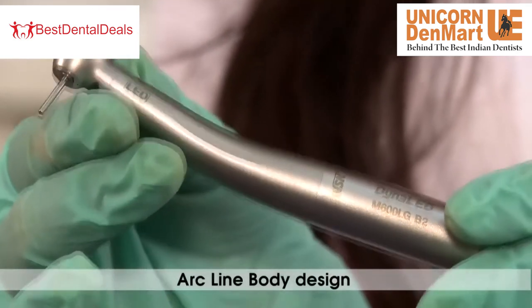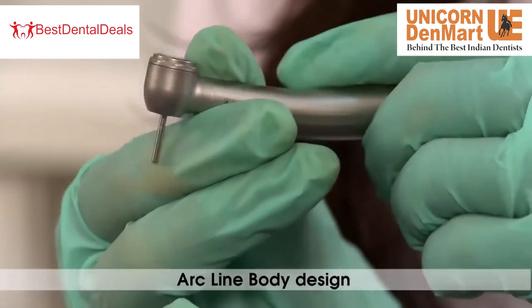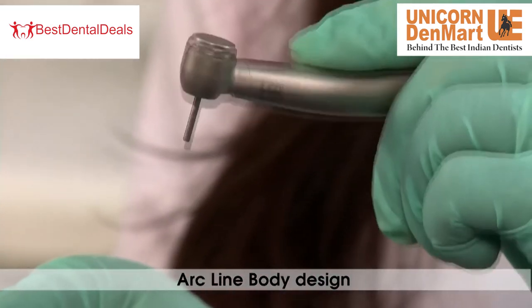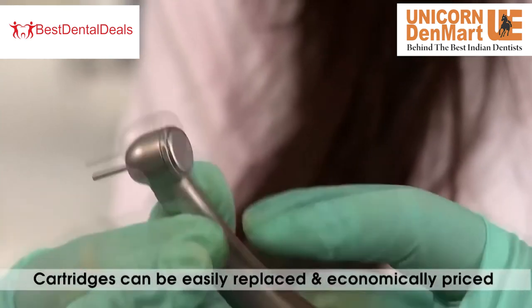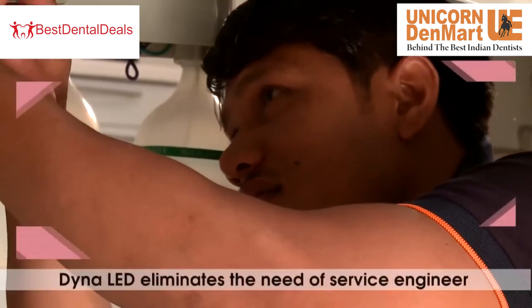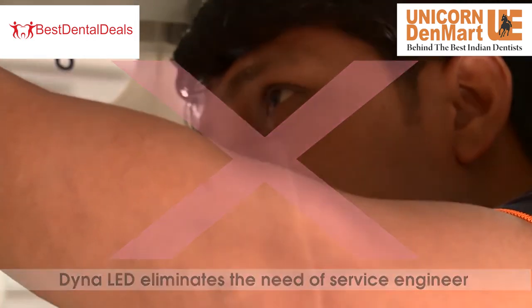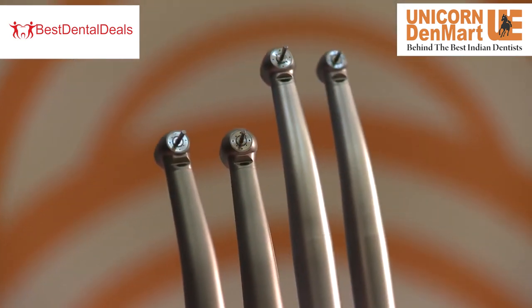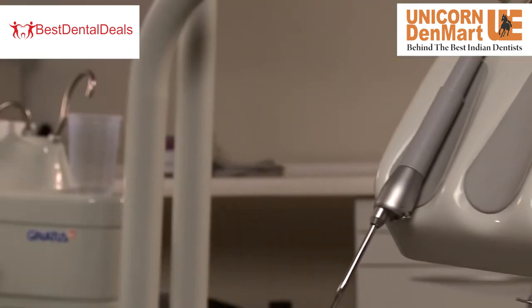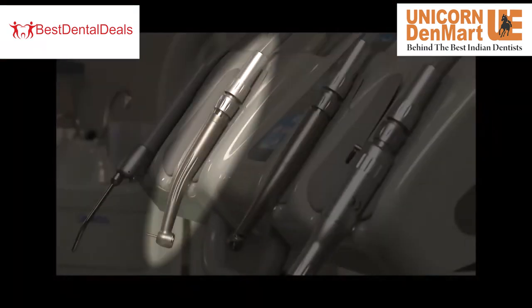It has an ergonomic arc line body design and is available in both miniature head and standard head models. Cartridges are easily replaced and are economically priced, reducing your cost and time. The Dyna LED handpiece eliminates the need for a service engineer unlike other optic handpieces, making it highly cost effective and a boon for dental professionals.